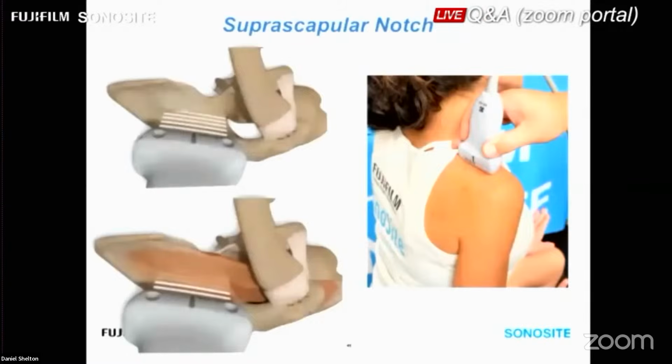This is a really superior view. Think of that Netter's view of the rotator cuff. We're looking down on the body, looking down on the shoulder. So here's the AC, the supraspinatus going underneath it in the supraspinatus fossa. We can see the beam is planted midline to the supraspinatus, which is like mid-coronal to the body plane. Patient positioning doesn't really matter. The patient can be nice and neutral for this exam. And my tip, and we'll show this tip while we scan, is to look at the posterior edge of the probe on the anterior edge of the spine. Sorry, I'm going to back up again, of the scapular spine.